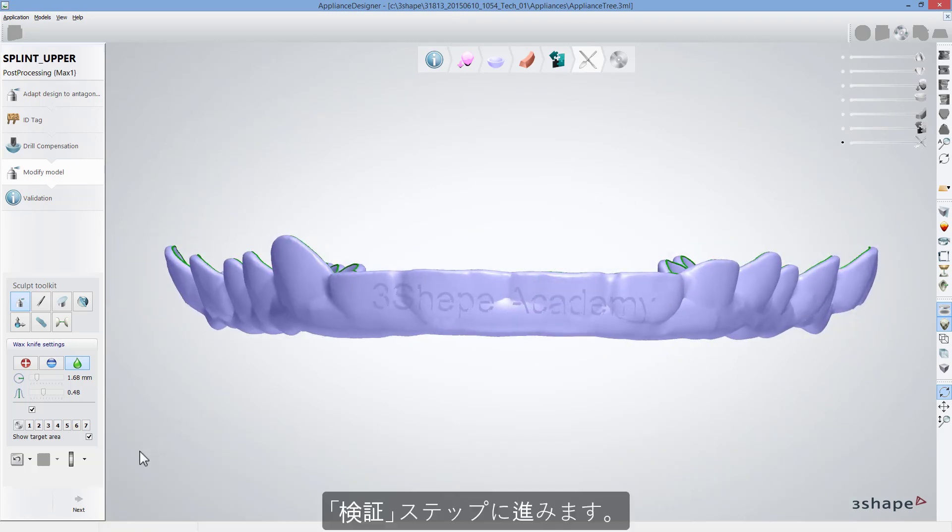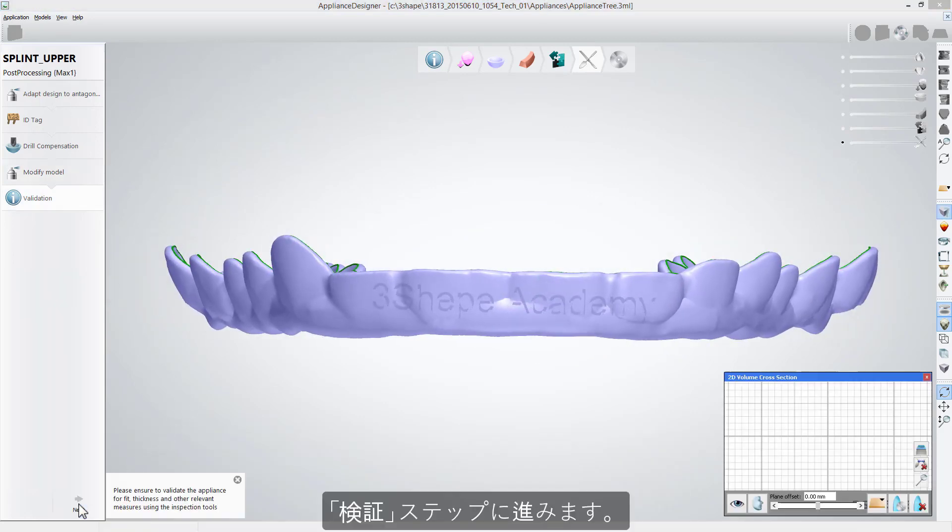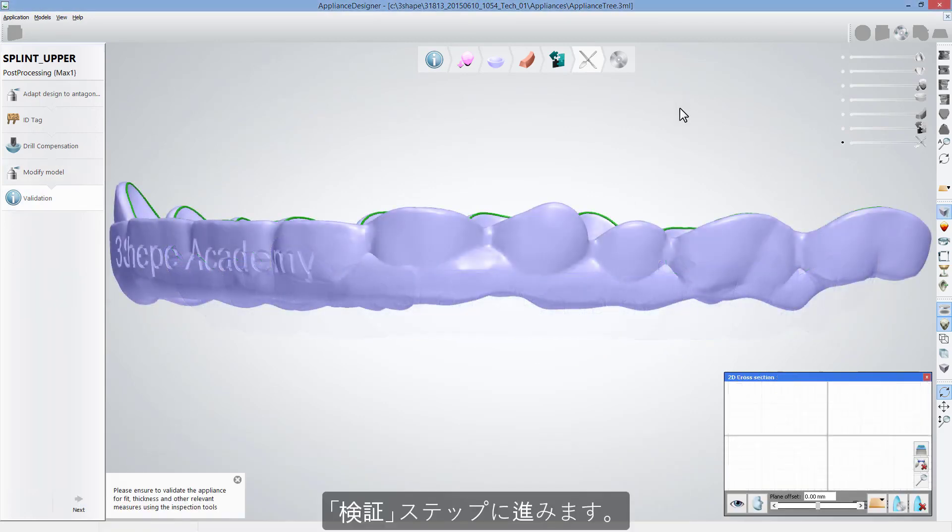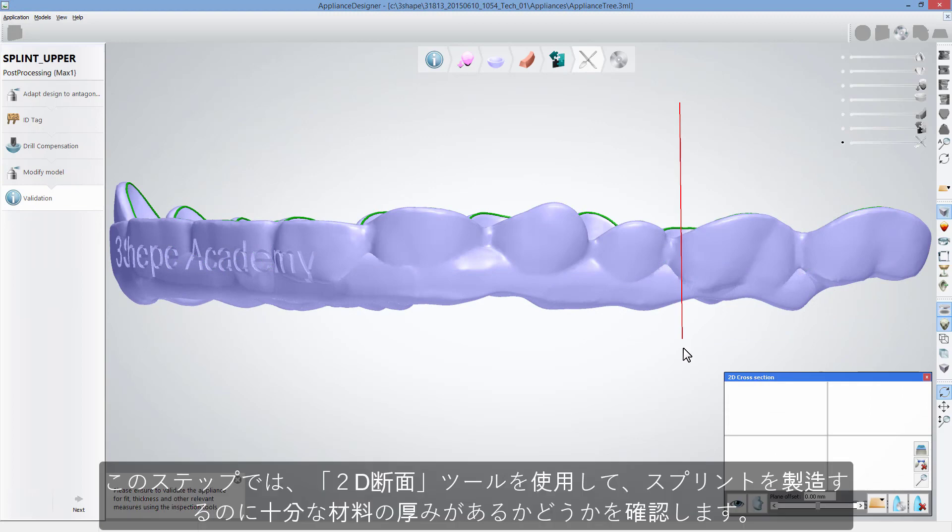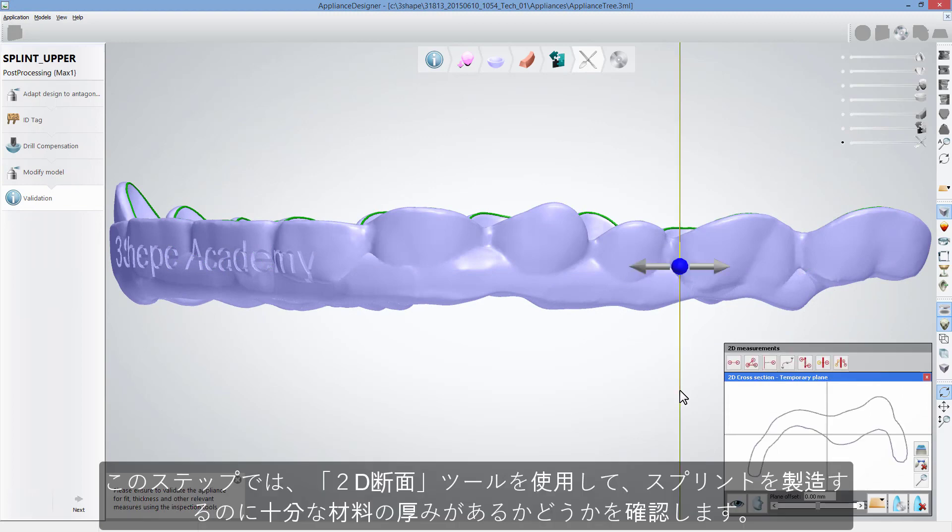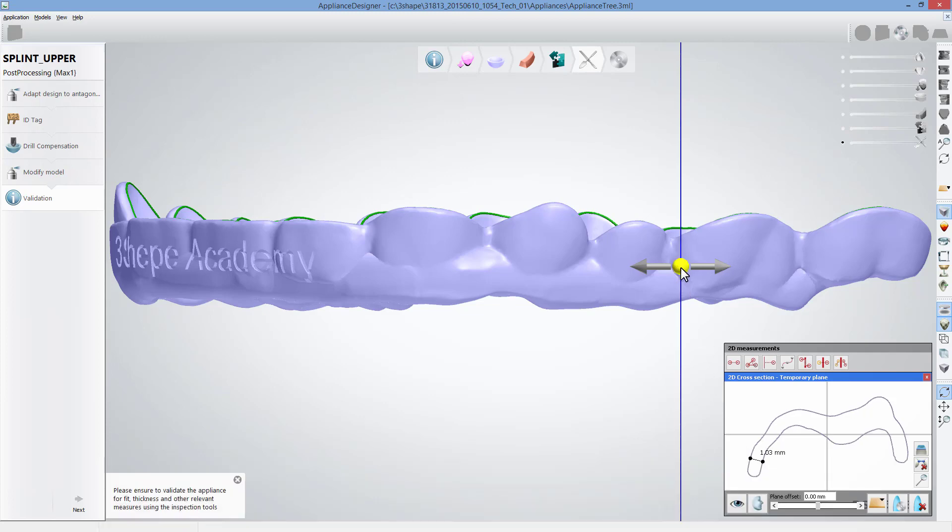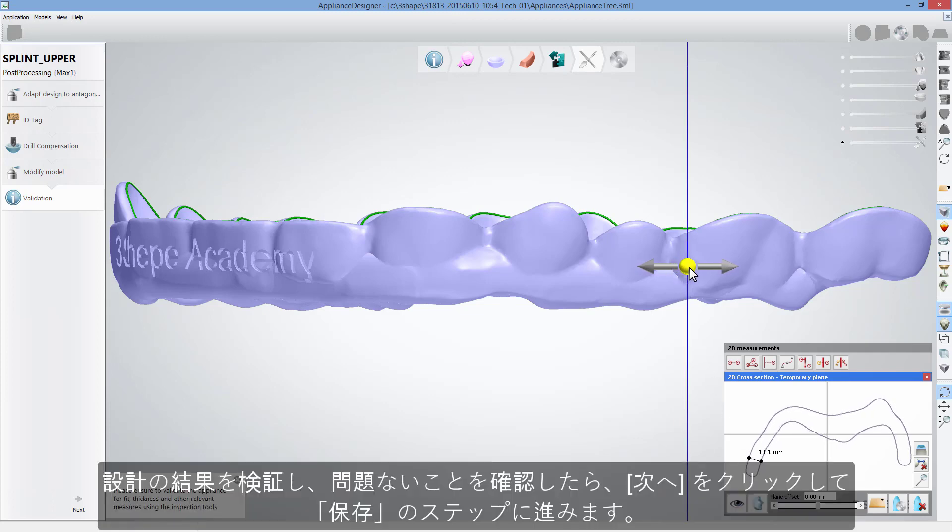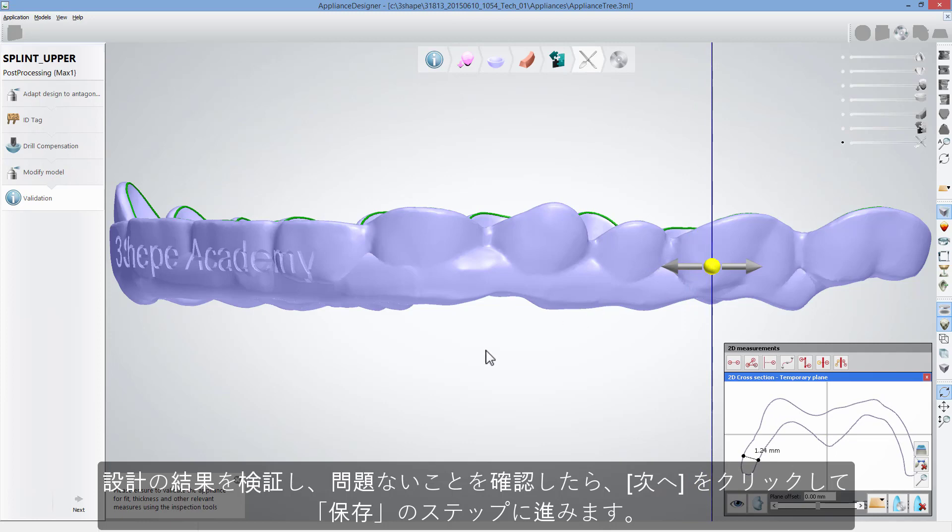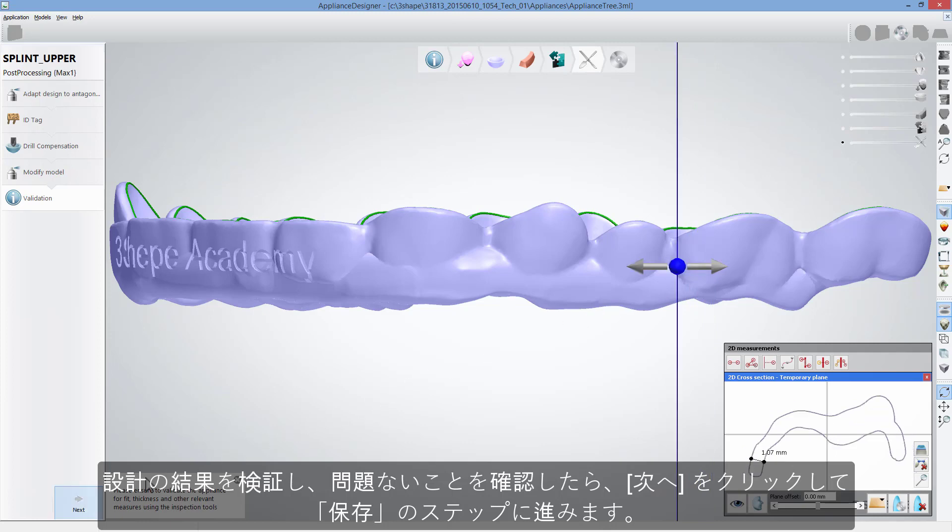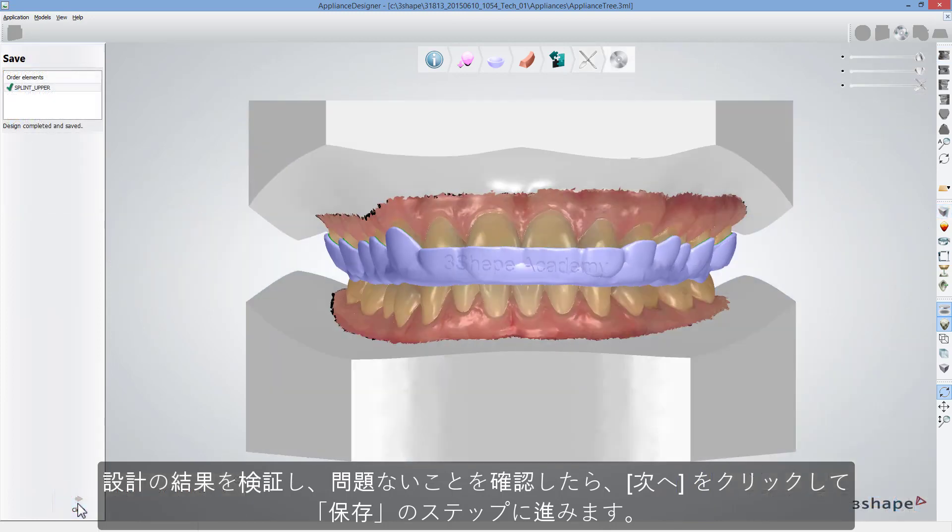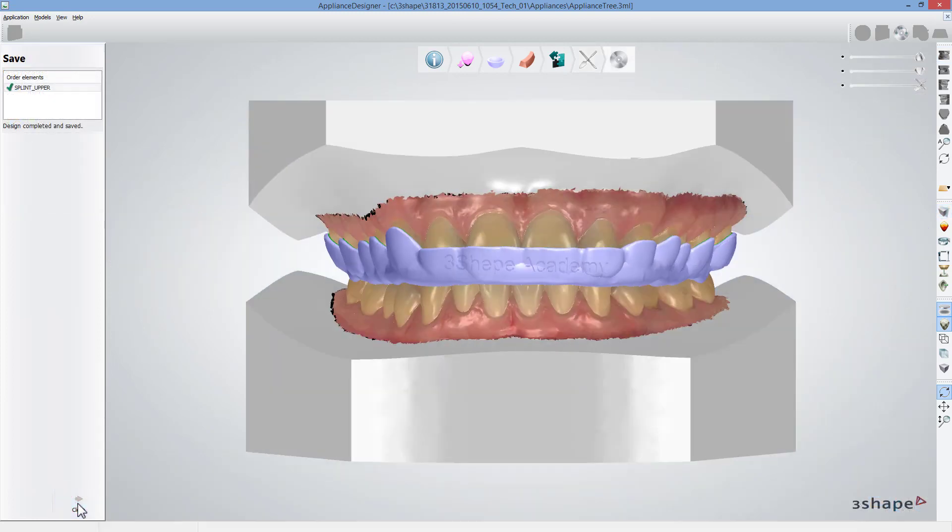When done, click Next to move to the Validation step and use 2D Cross section to check if there is enough material thickness for the splint to be produced. After validating your design and making sure that everything is all right, click Next to get to the Save step.